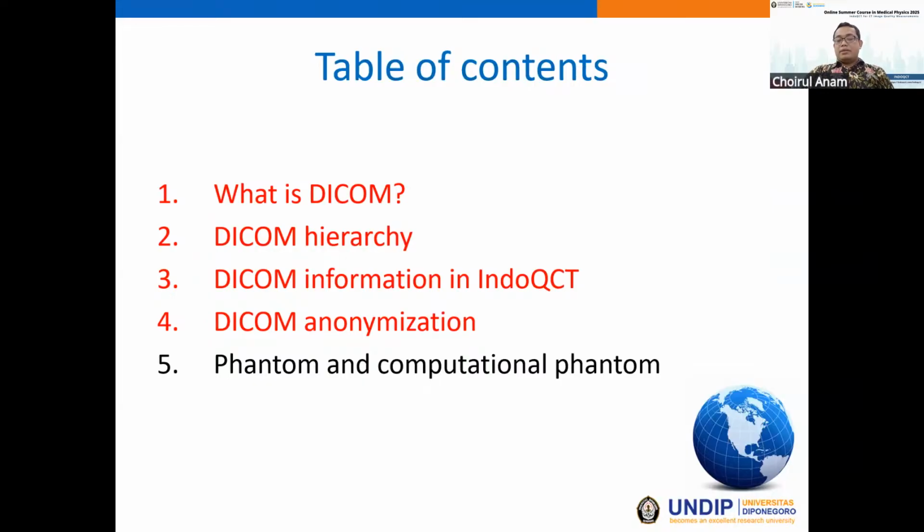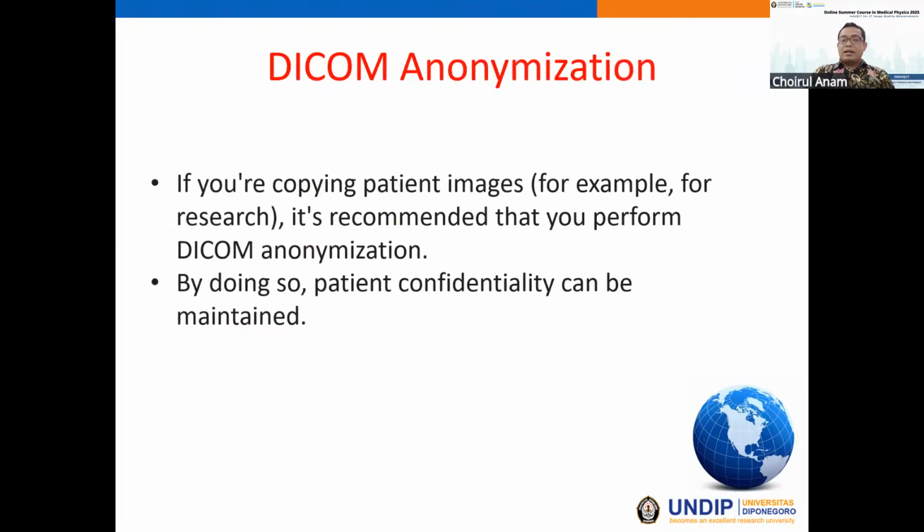And then we move to the DICOM anonymization. If you are copying patient images, for example, for research or other purposes, it's recommended that you perform DICOM anonymization.